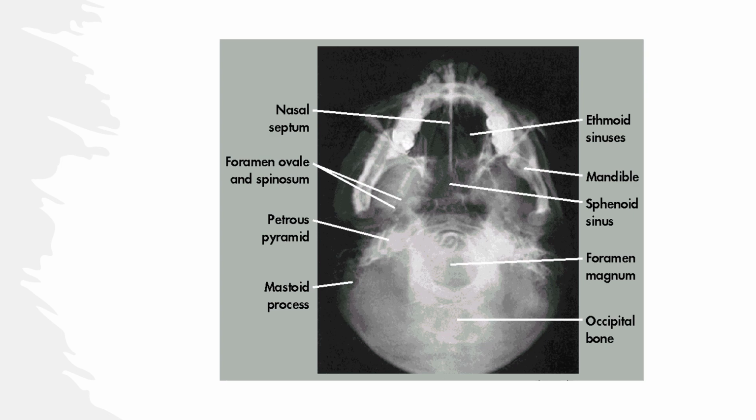You need a patient with a flip-top head so they can get their head all the way back so that the infraorbital meatal line is vertical on a standing radiograph of the SMV, parallel with the image receptor on a supine radiograph. I've never seen this done supine.